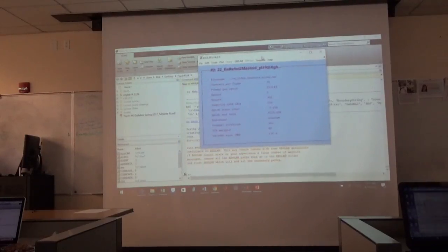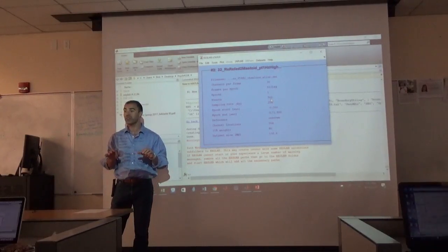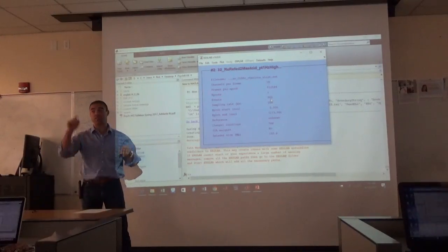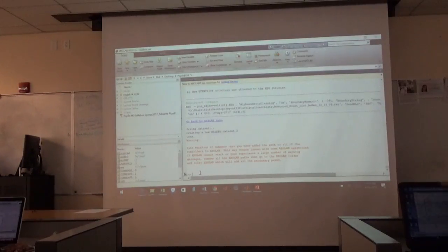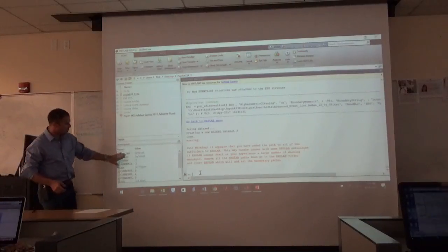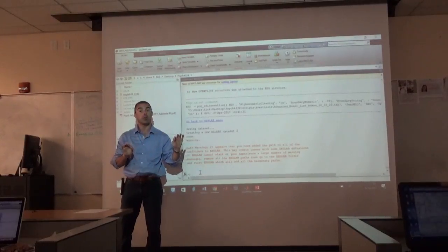So that's a lot that we worked through, right? It's a lot of moving through the GUI, with a lot of mouse clicks. You guys want to see a nifty little trick? We won't get into too much of it now, but I just want to give you a little teaser for where we'll move into in a little bit. Remember I promised at the beginning of the course that we'll accidentally learn to code a little bit? In case you got tired of clicking around, once you set up what you want to do, that's remembered in our workspace here and in the history of MATLAB's commands, because I have not yet cleared it out.